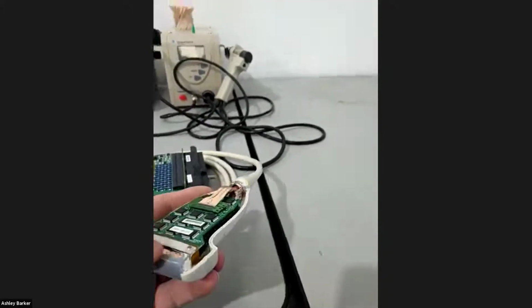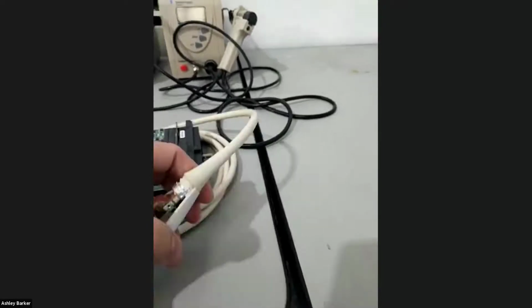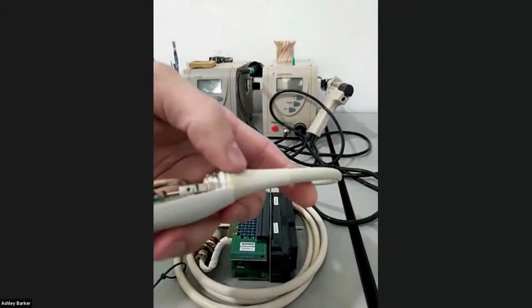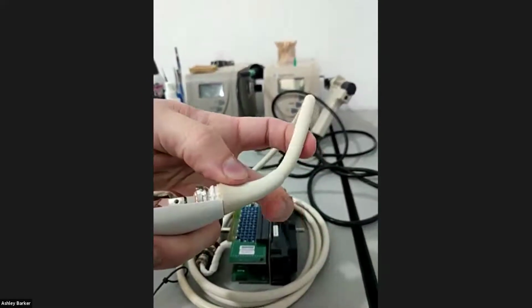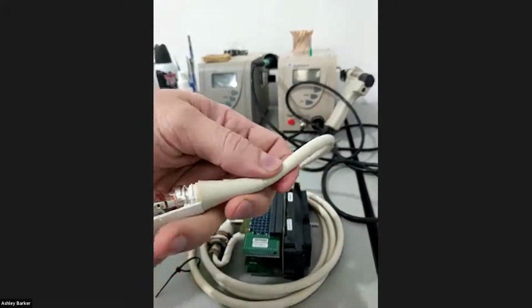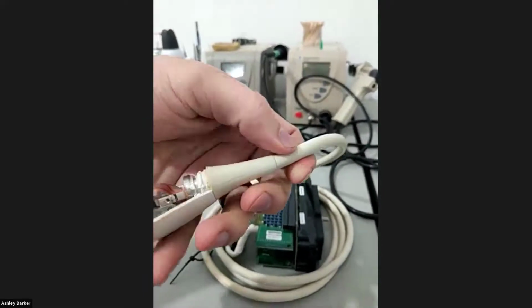Okay. So getting some of the terminology right, this section here is the strain relief. Its purpose is, as the cable gets pulled and bent, it allows the cable to bend over a larger radius rather than just bending on one spot where it will eventually break.